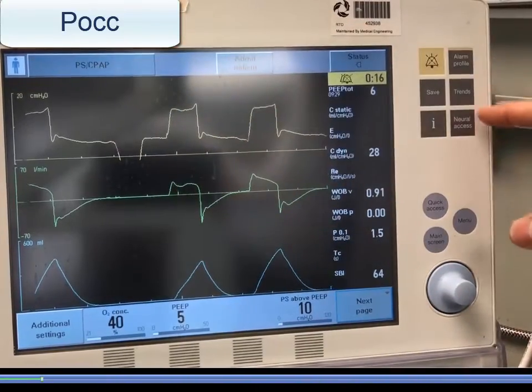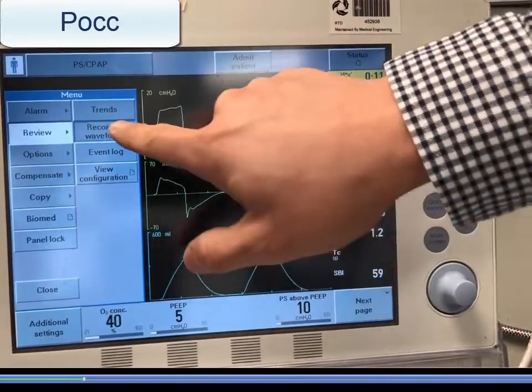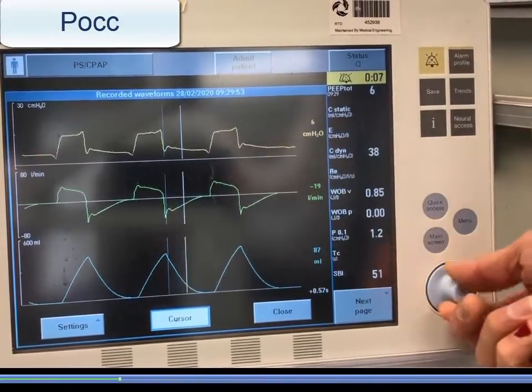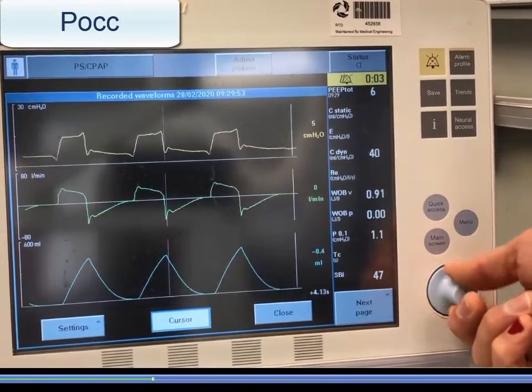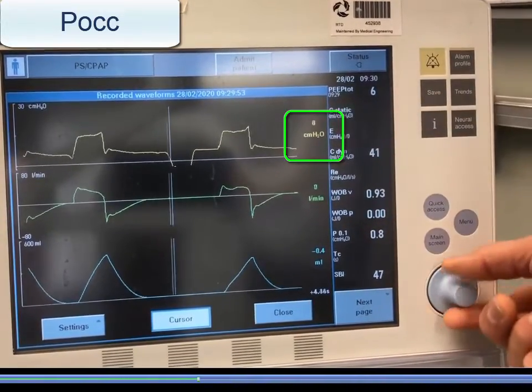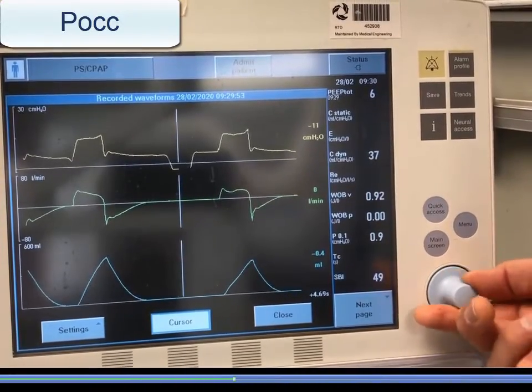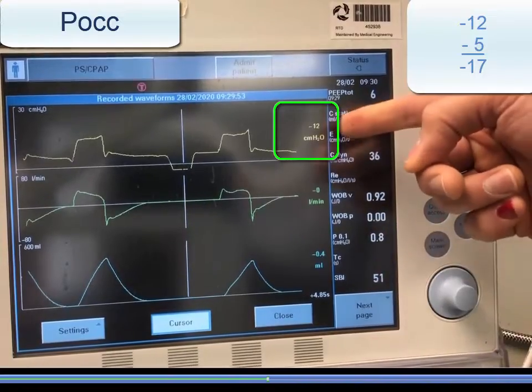Select menu, review, and recorded waveforms. Scroll over to the first occluded patient effort to determine the baseline PEEP, which in this case is 5 cm of water, and the maximal trough, in this case minus 12. This gives a Pocc, occlusion pressure of minus 17 cm of water.